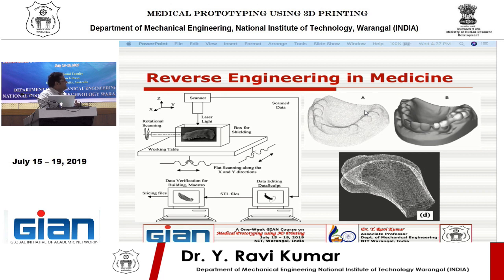So you digitize it, collect the cloud of points, and then approximate or create a surface patch. Then whatever the bridge or crowns, that is the patient data, and you can modify it. In the software and on the computer, you can do a lot of customization for this patient, right? This is the approach wherever you have applications like limbs, ear, nose, and all these prosthetics.